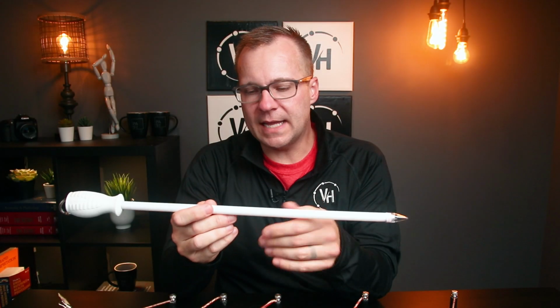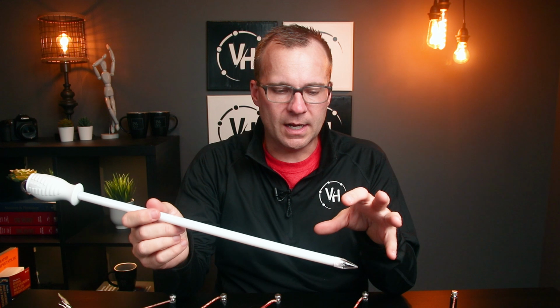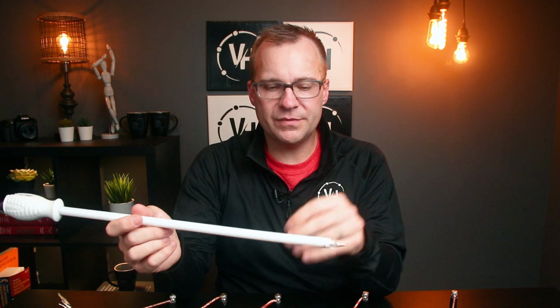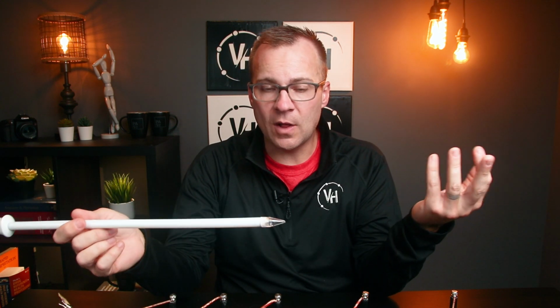Now let's pretend that you made your incision, you made your pocket, and you don't see the saphenous vein. That is a problem on occasion if it's a deep saphenous or it's a small sized saphenous vein. Sometimes you don't encounter it right away. Maybe your incision's in the wrong spot. I mean, it all happens.